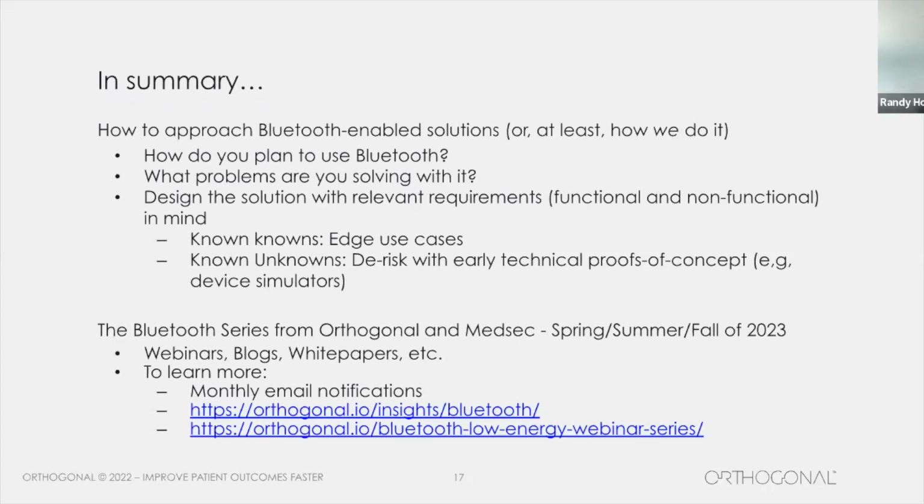Okay, great. So actually we have an in summary, but before that, in case anybody drops off, there's a question that came in. I feel like we need to answer immediately for those of you who actually have active implantables. It says, in MRI safe mode, is the device turned off? Bernhard? No, it's not. It's put into MRI safe mode, which is a low power mode, not turned off.